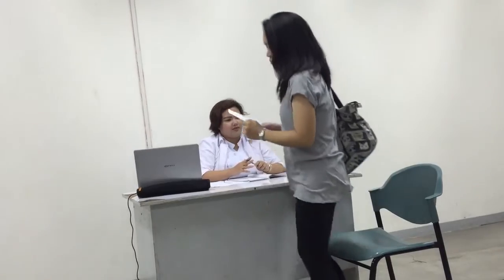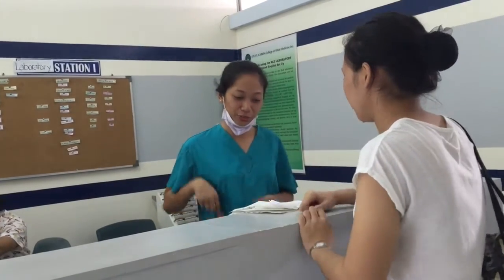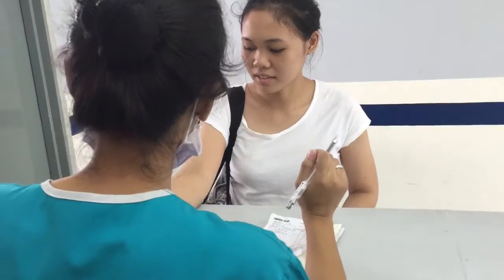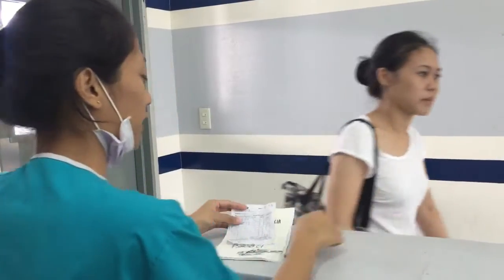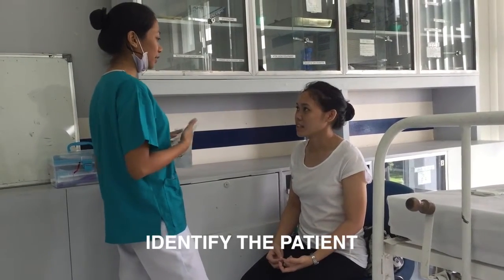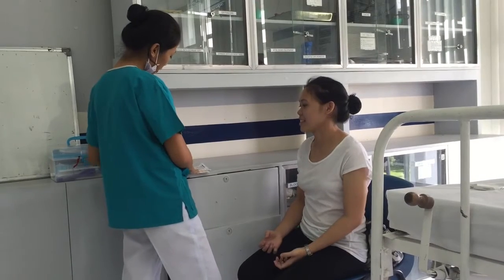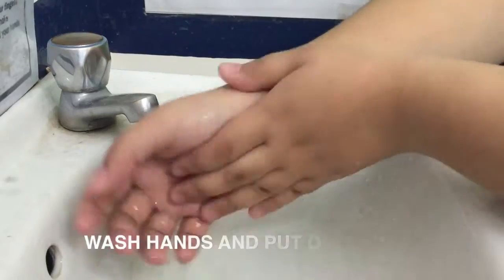The doctor ordered a laboratory test to check her complete blood count. First, identify the patient and check the name of the patient. Identify yourself and introduce yourself to the patient as the medical technologist assigned. Check the fasting state of the patient, as some tests require the patient to undergo fasting or not eating for a certain time. Wash hands and put on gloves.